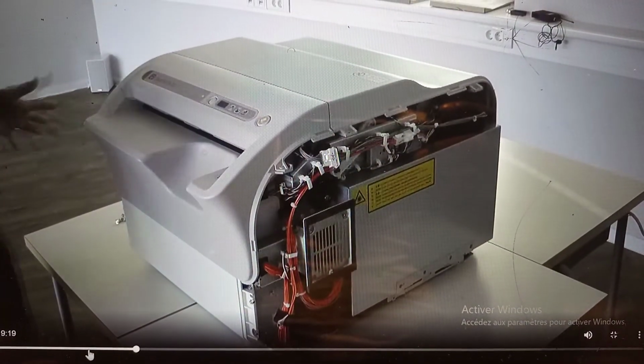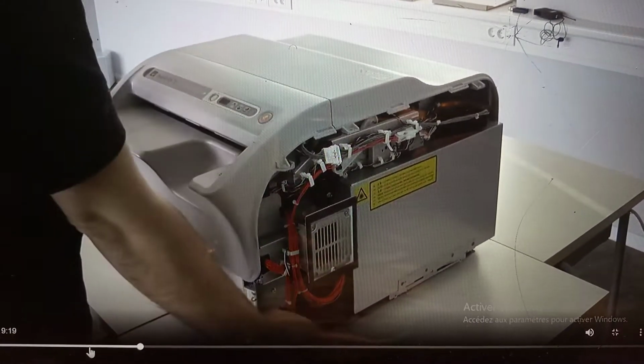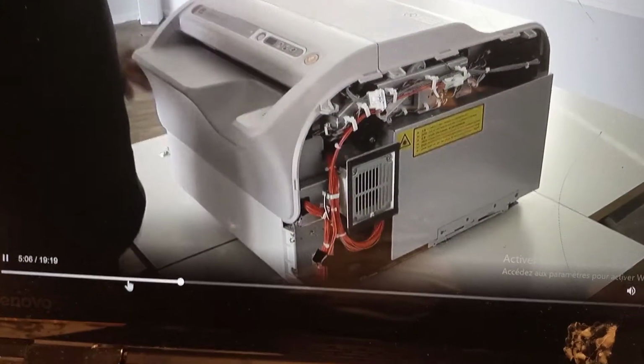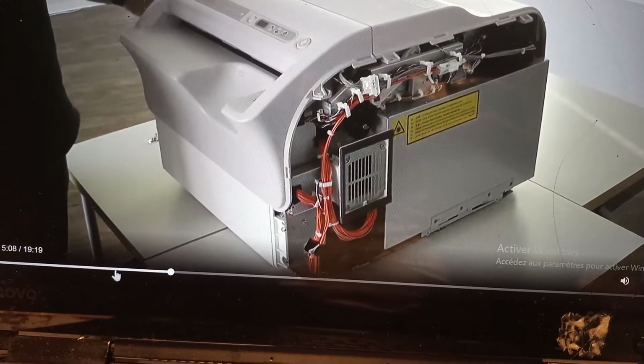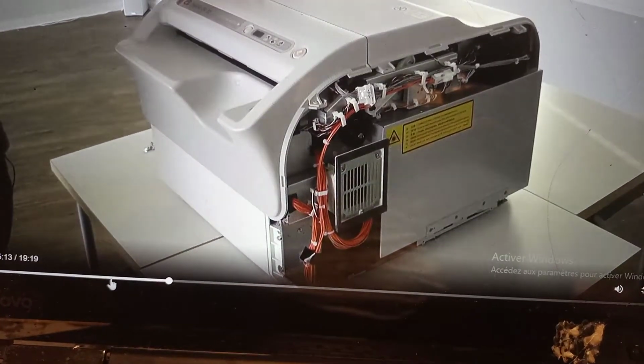So after removing the left side of the device, it's the same procedure as on the right side, just the 3 screws on the bottom and lift up the side cover. We want to remove the top cover and the backside cover.